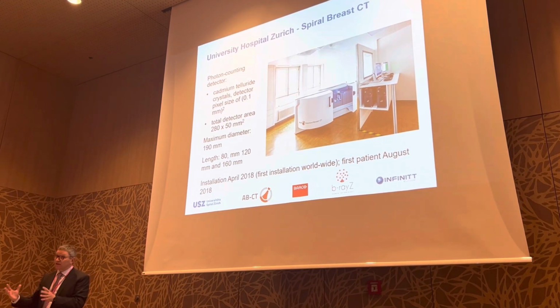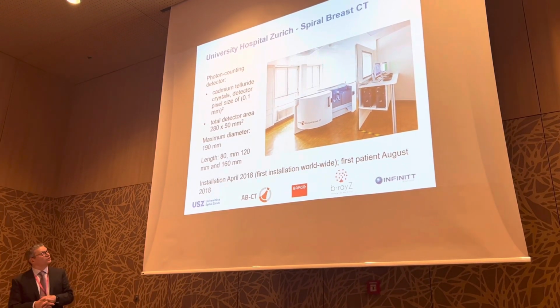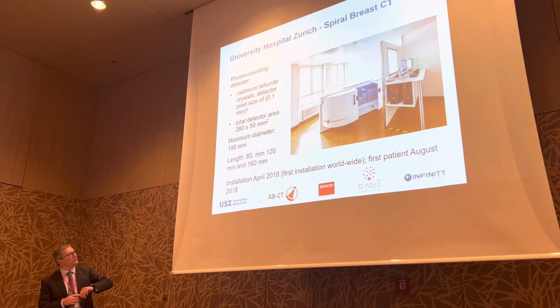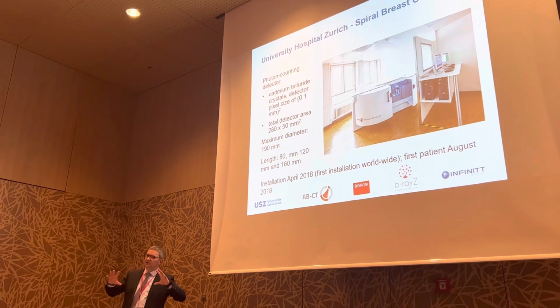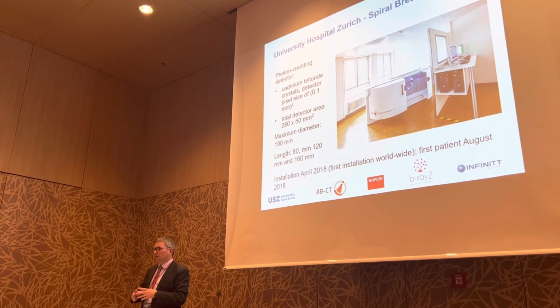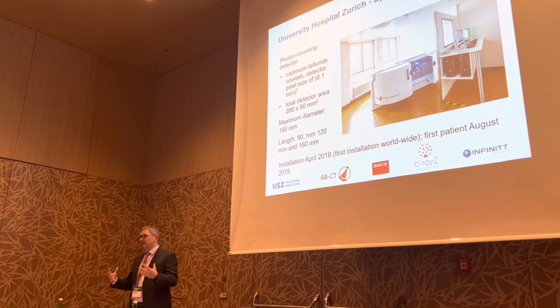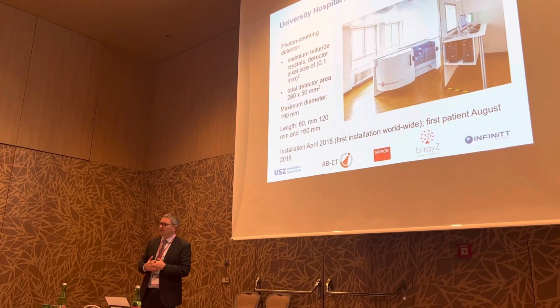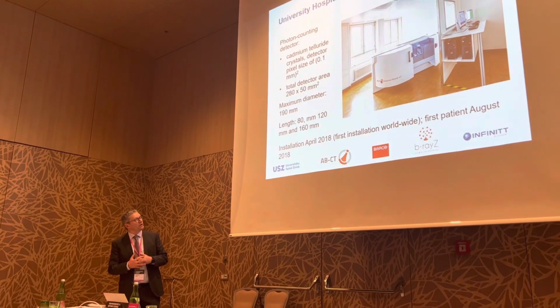So you give it a scan range which you want to cover, and the maximum diameter of the breast is 190 millimeters. Actually, these sizes are sufficient for, let's say, examining 99.9% of patients. Almost all patients can be examined with that system.